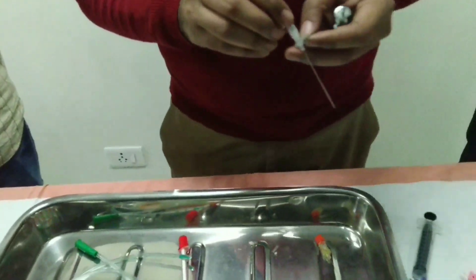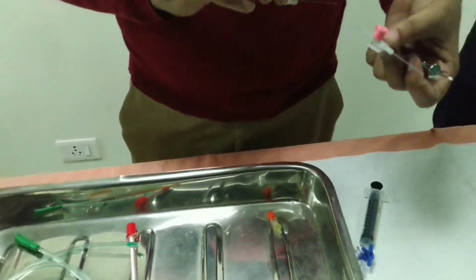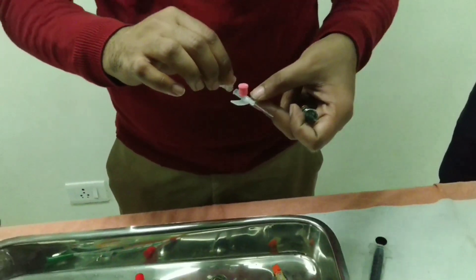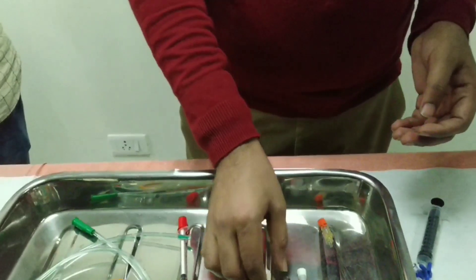If you use the lumbar puncture needle, it is very costly. We use the lumbar puncture needle in this department.